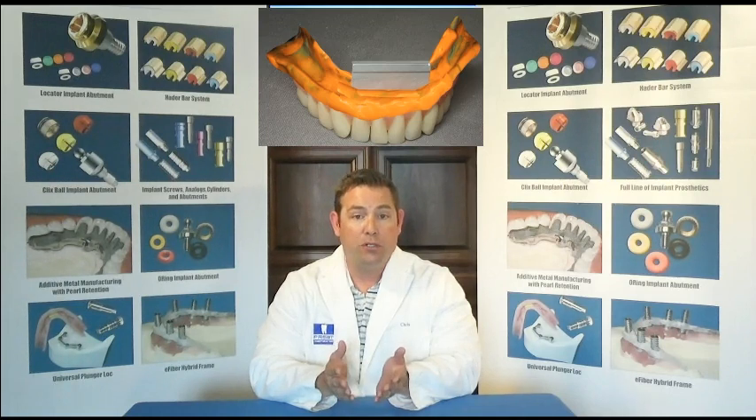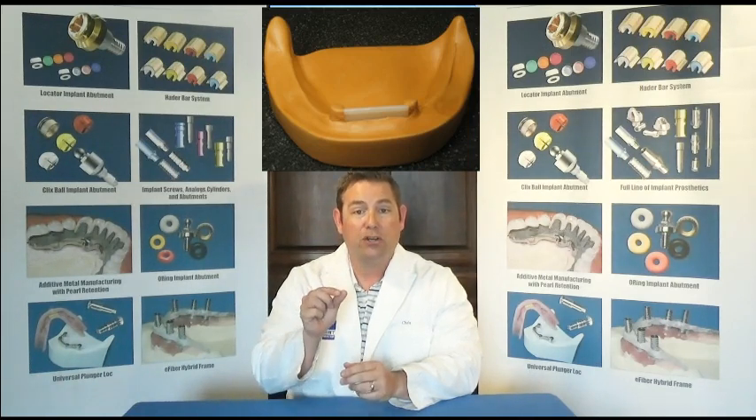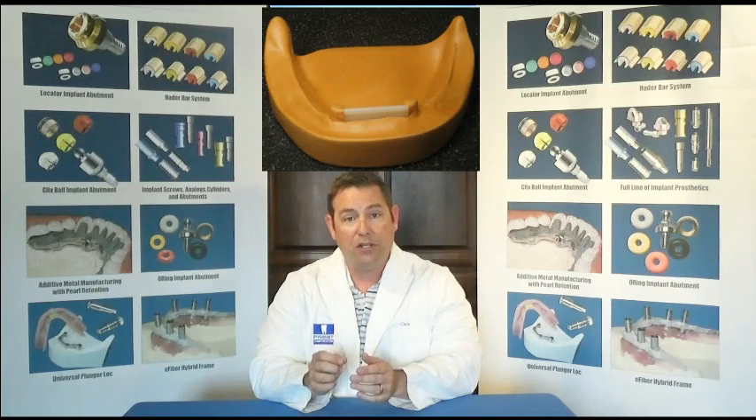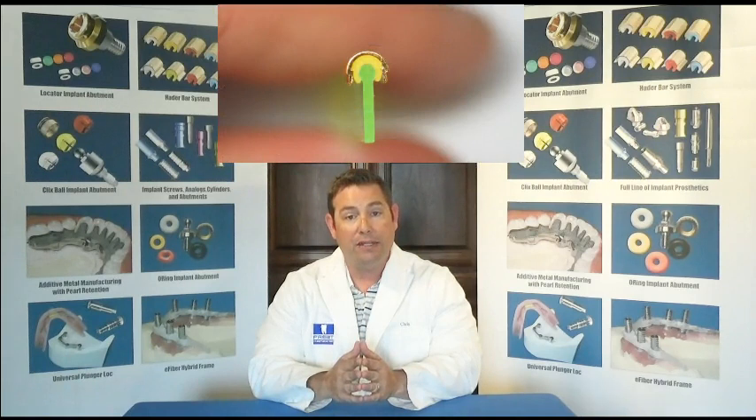If you choose to pour up this cast in stone without the analogs, you're running into the potential of having the cast fracture, simply because the original Hader bar was made with a one-millimeter, very thin skirt segment. When you snap a bar under the stone duplication of the bar, there's a very good chance it will fracture. The analogs are much more accurate, easier to work with, and will give you a true representation that you can work off of.